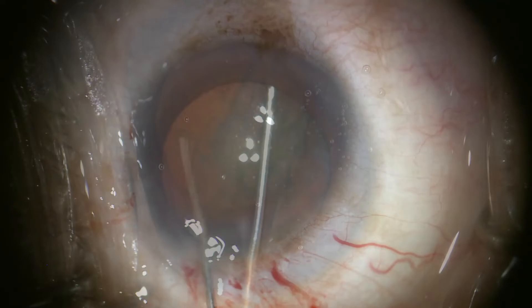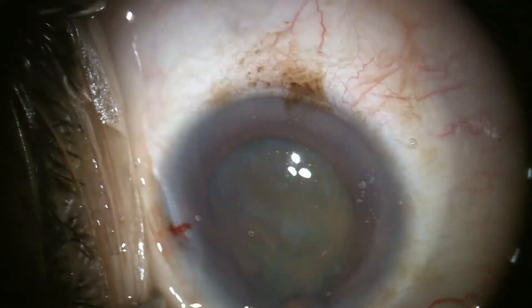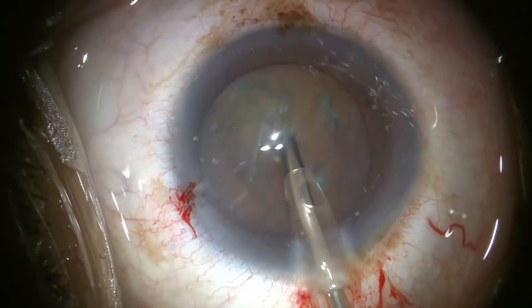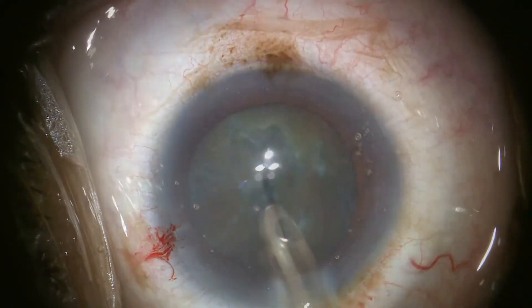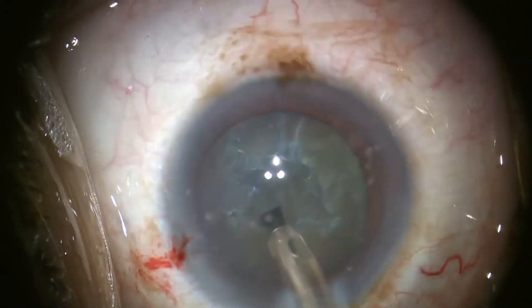Effective hydrodissection is needed to allow the lens to be freely rotated. The FACO tip goes in with the bevel turned sideways to minimize the chance of creating a Descemet's flap. Sculpt mode with good cutting power is used to create a small central bowl with goals of achieving relatively vertical sidewalls and a thin bottom.